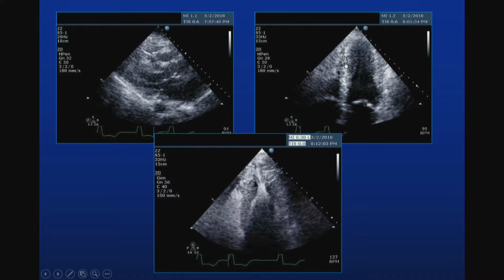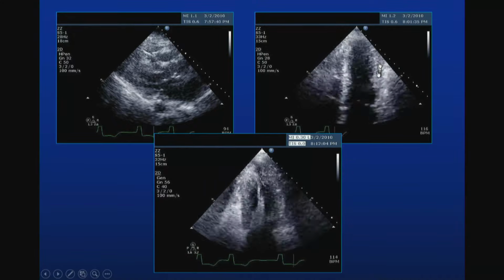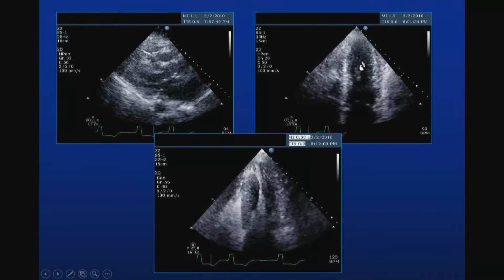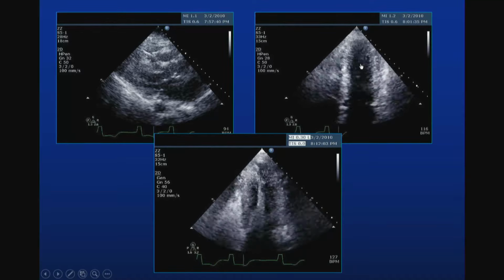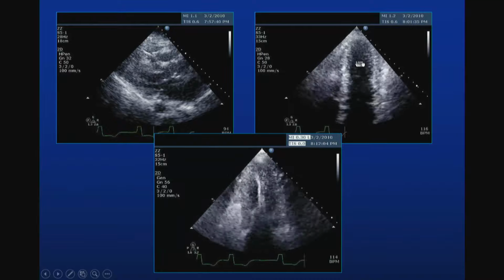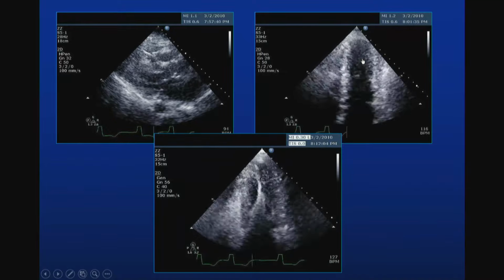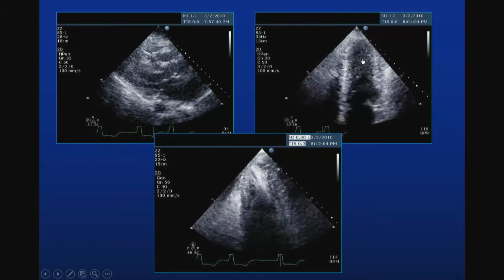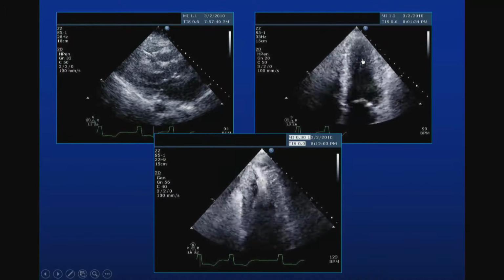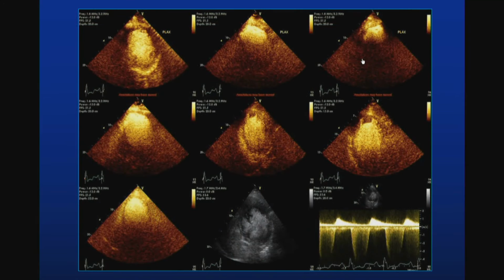The clue from here, if you go back, is that if you have no epicardial motion, either there is a wall motion abnormality inside here, right? Or you have a lot of hypertrophy and there isn't much place for the endocardium to move further inward in this situation. So please, if you see something like this, you have to use contrast to enhance what you did.